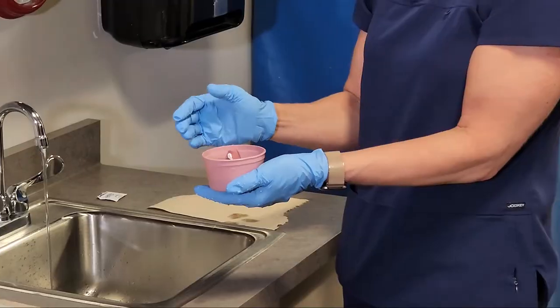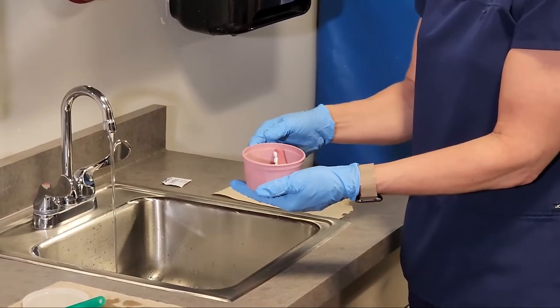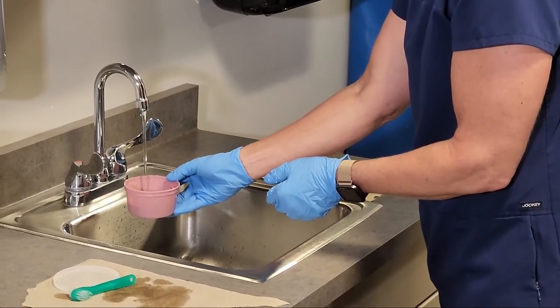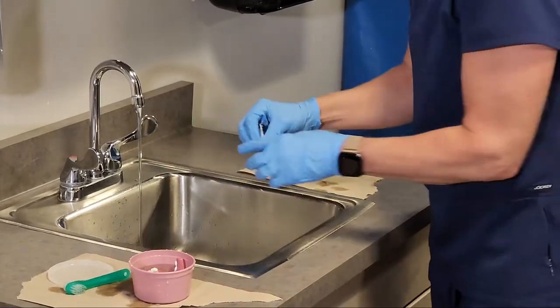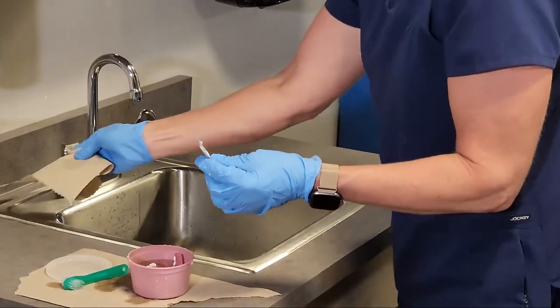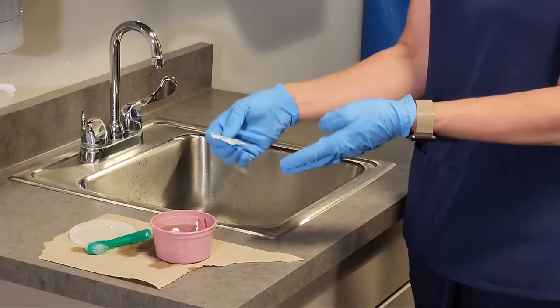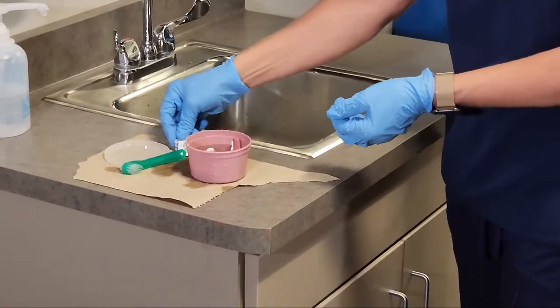It's easier to put the dentures in if they are still a little bit wet. If they're going to store overnight, I need to fill that cup up with water and make sure that the dentures are covered. And then if the resident prefers, we can put a denture tablet in there to clean. If I were getting those out in the morning, I would scrub again to get the cleanser off of the denture.